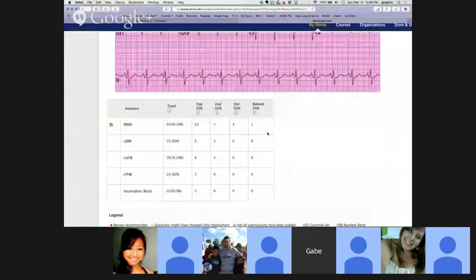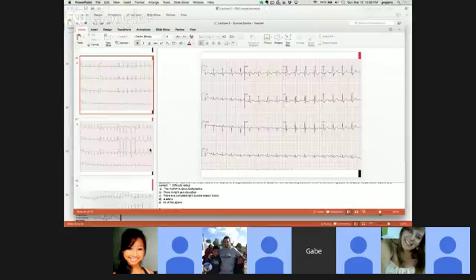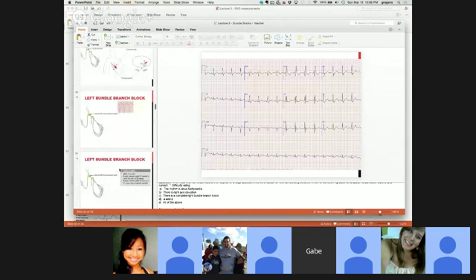Right. And so you would never have a diagnosis of a left bundle branch with a left anterior or left posterior hemi block. It would typically just be a complete left. Correct. So we talk about bifascicular blocks, which is a block of the right bundle with a hemi block.